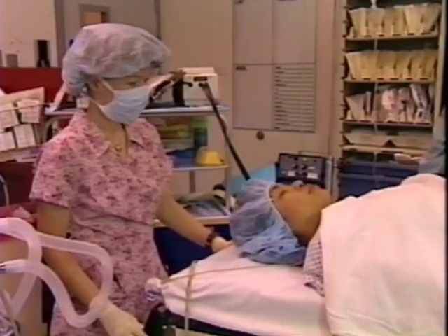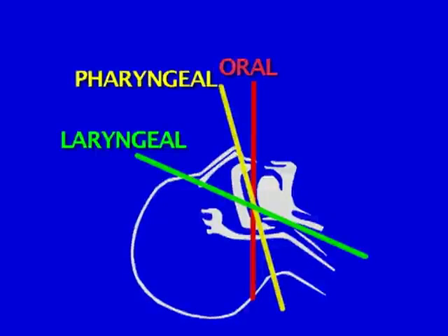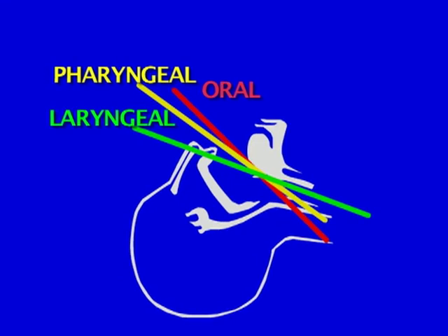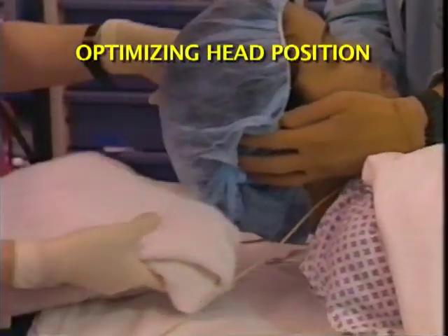To intubate, you need to bring the path from the incisor teeth to the larynx into a reasonably straight line. This path has three axes: the oral axis, the pharyngeal axis, and the laryngeal axis. Since these axes don't naturally line up, aligning the axes requires optimally positioning the patient's head and neck and then using the laryngoscope and blade to make the final adjustment. Optimizing head position is a key step for success.